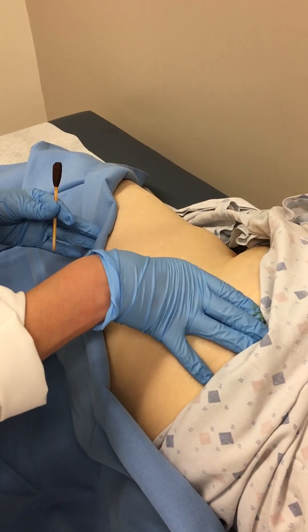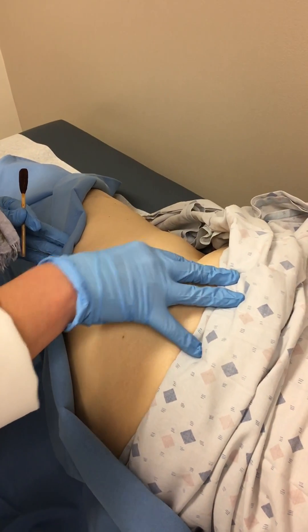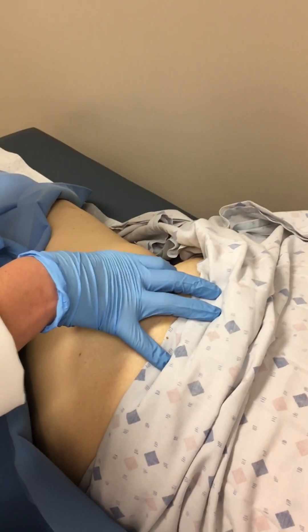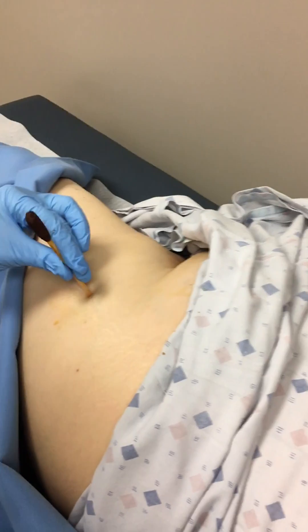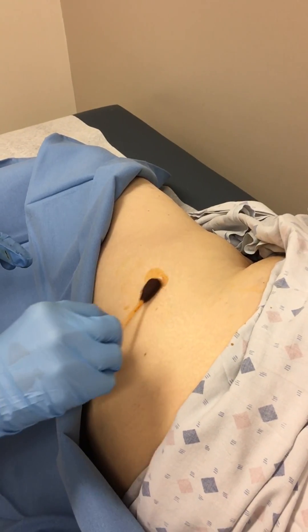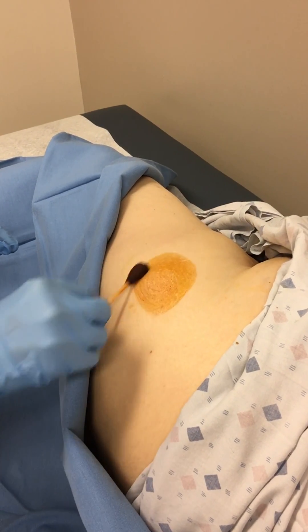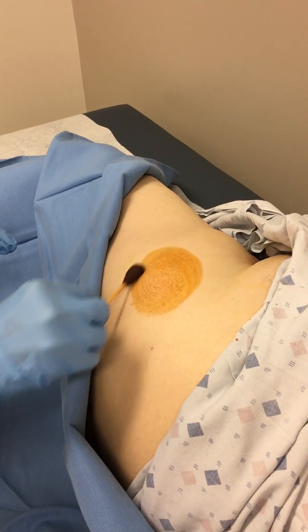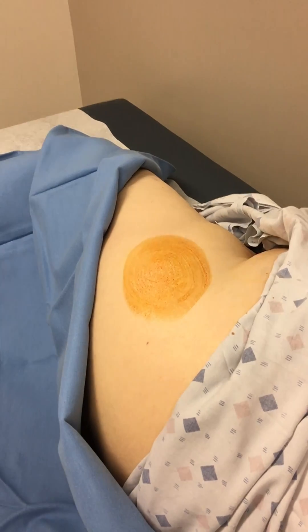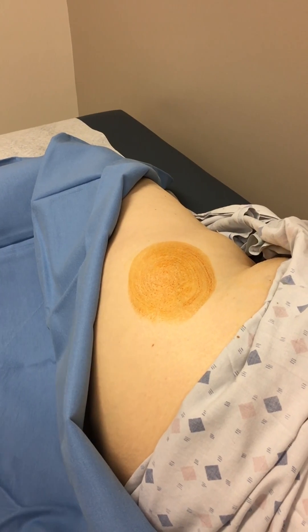So I'm palpating and asking the patient to indicate when I'm right on the most tender spot. Once confirmed, I mark the spot — you can use a surgical marker or the tip of the cap from the syringe as well. Typically you'll be right over the greater trochanter, but by finding the point of maximum tenderness we'll hopefully give the most relief.